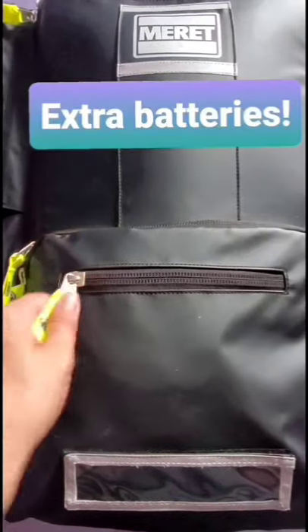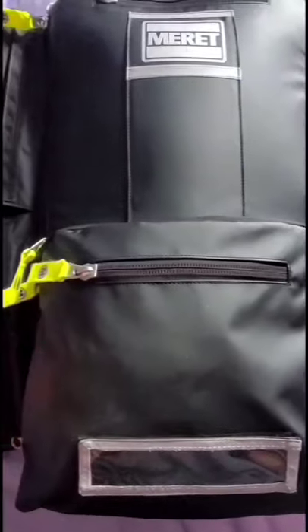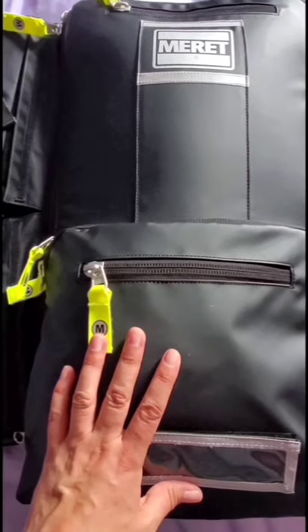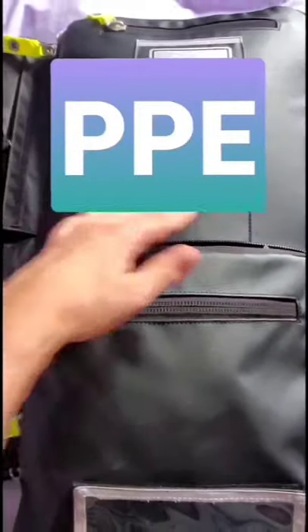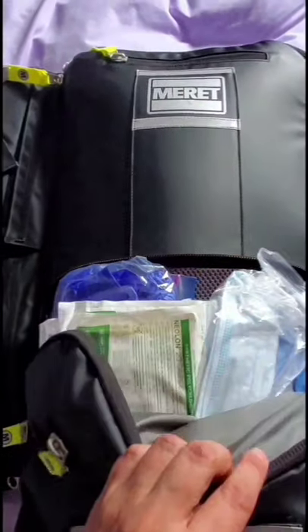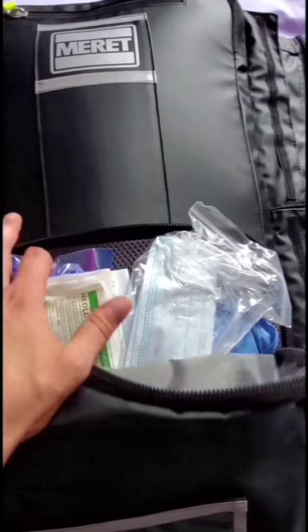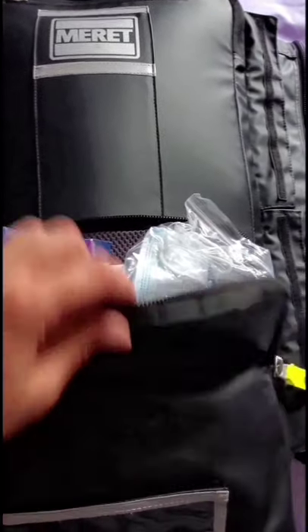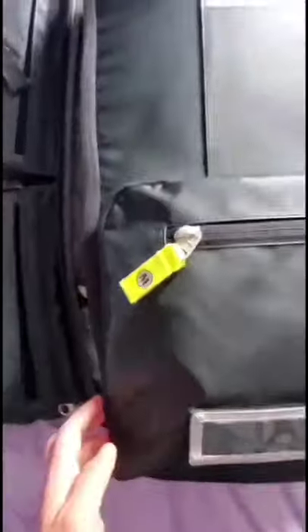In this top pocket I keep extra batteries — I'm always worried about running out of batteries for my doppler, thermometer, or O2 sat monitor. Then this top part is so that before I do anything else I can put on my PPE: I've got masks, gown, blue gloves, and sterile gloves, all easy to access at the top.